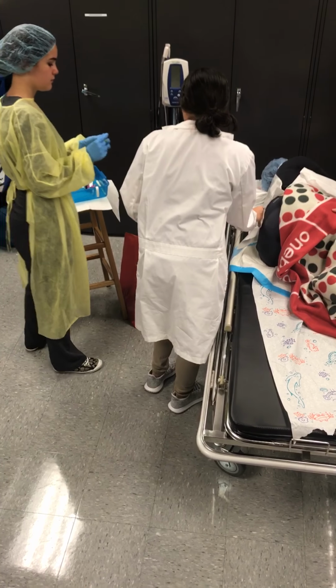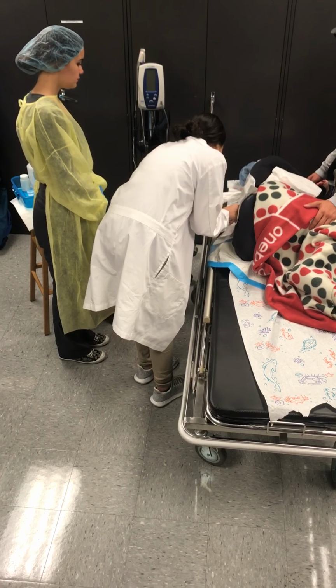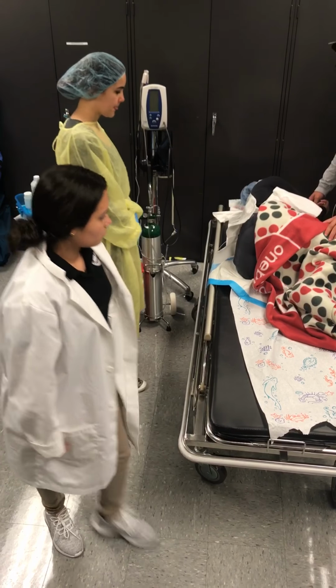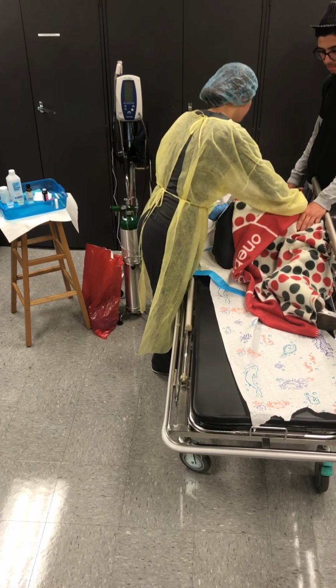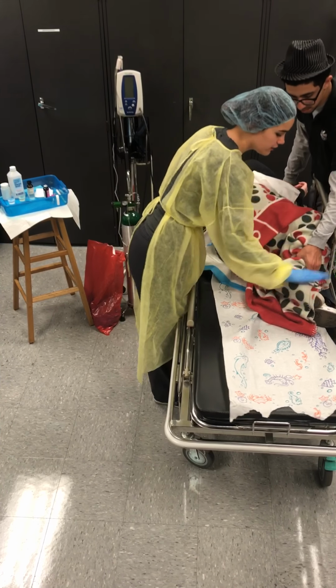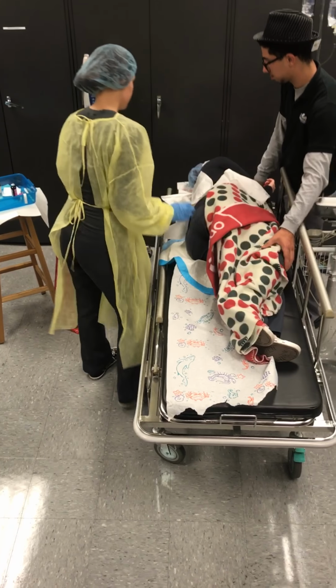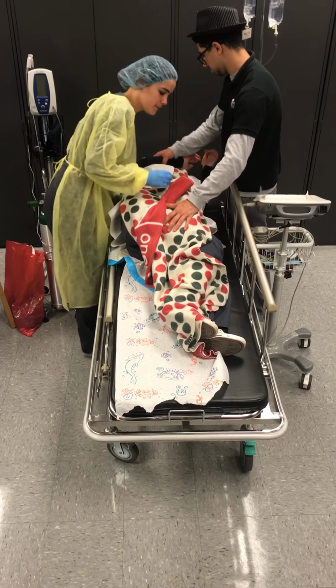A sterile dressing is applied to the puncture site. At the provider's direction, have the patient straighten legs. Okay. You can just straighten your legs for me. Just help her out. She doesn't feel anything much right now. Here we go. And you're just going to turn with your back towards the bed, okay?